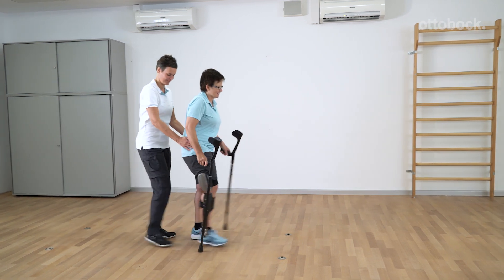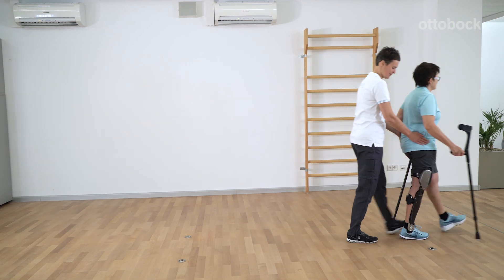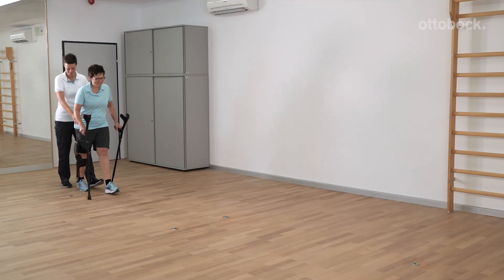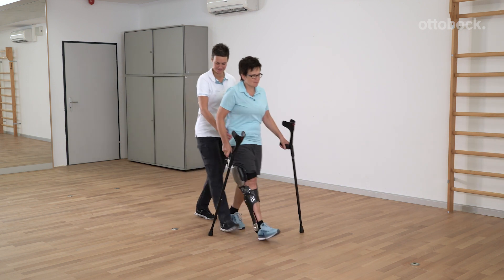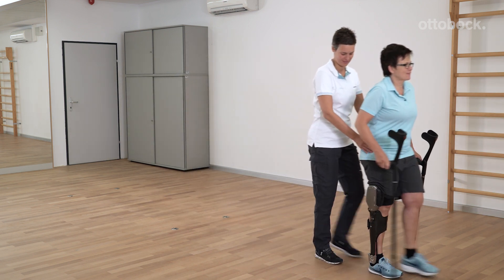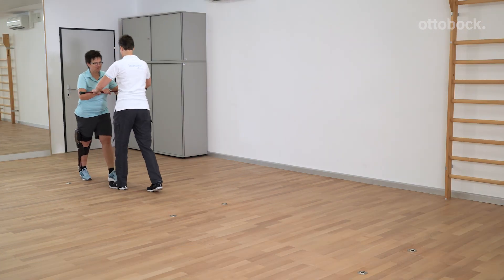Crutches turned back to front can also be used as an alternative. Walking while holding up a cane is another challenge.